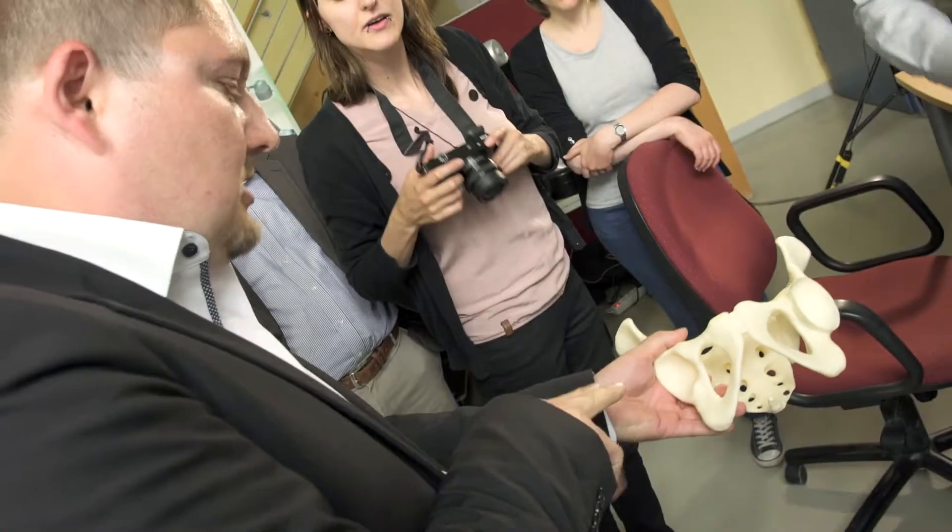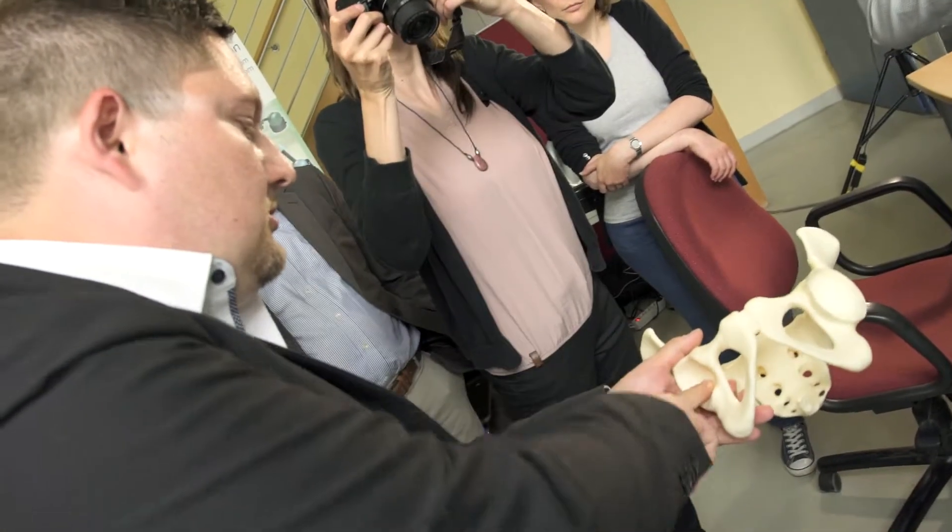Upon contact between the virtual reamer and the virtual bone, we can calculate forces and present them to the user using the robot, such that the user has the feeling of actually touching or reaming real bones.